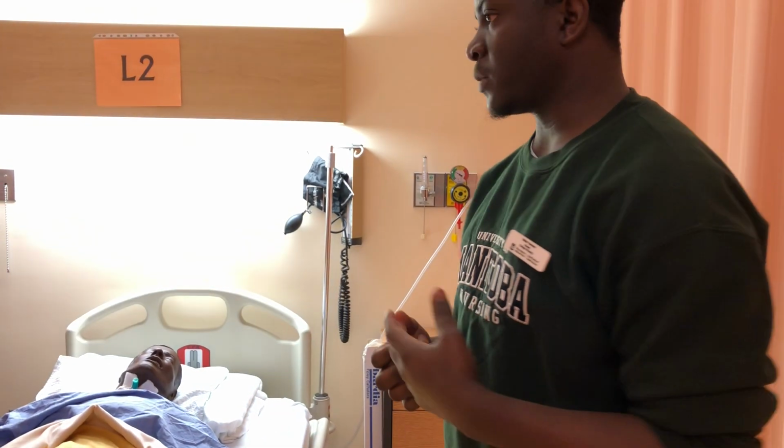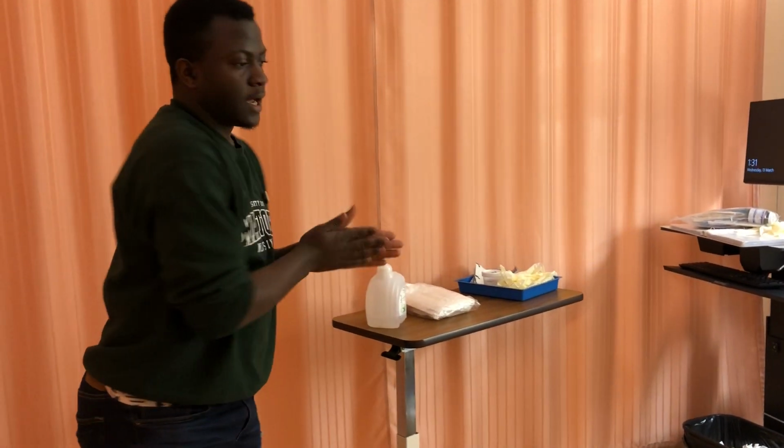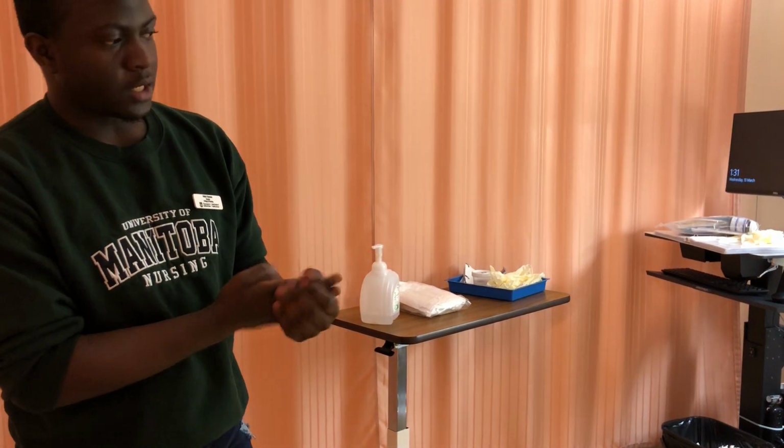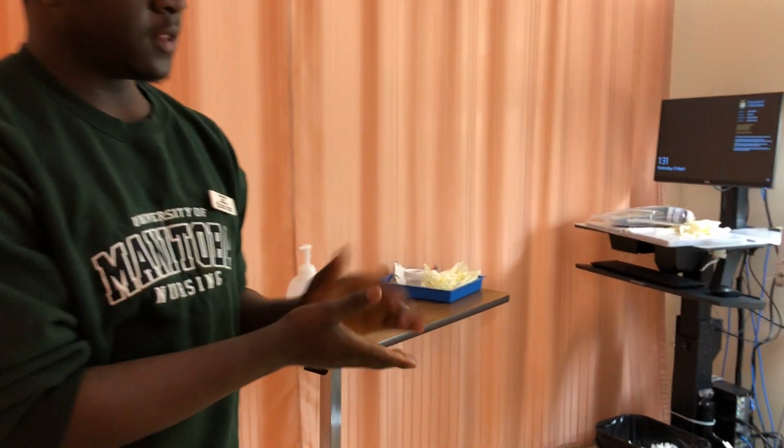As I enter the patient's room, I'm just going to wash my hands. And then I will be scanning for any safety hazards around. I see there are no safety hazards. The patient is in good condition.